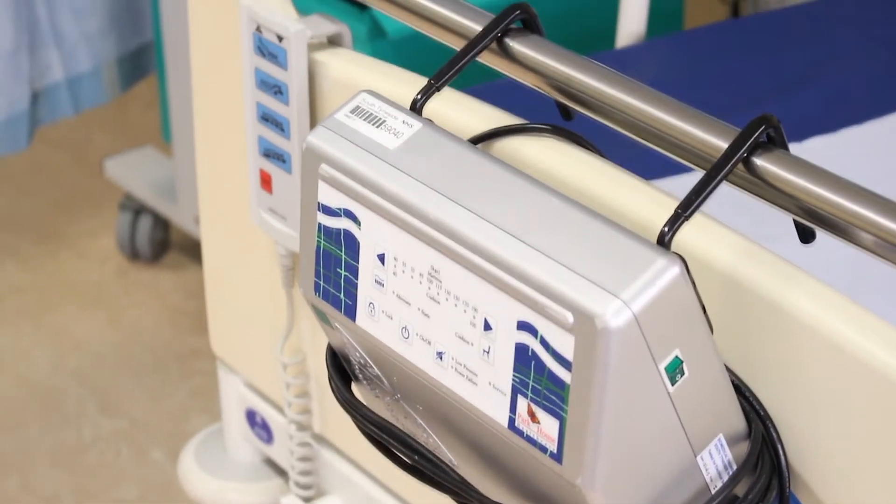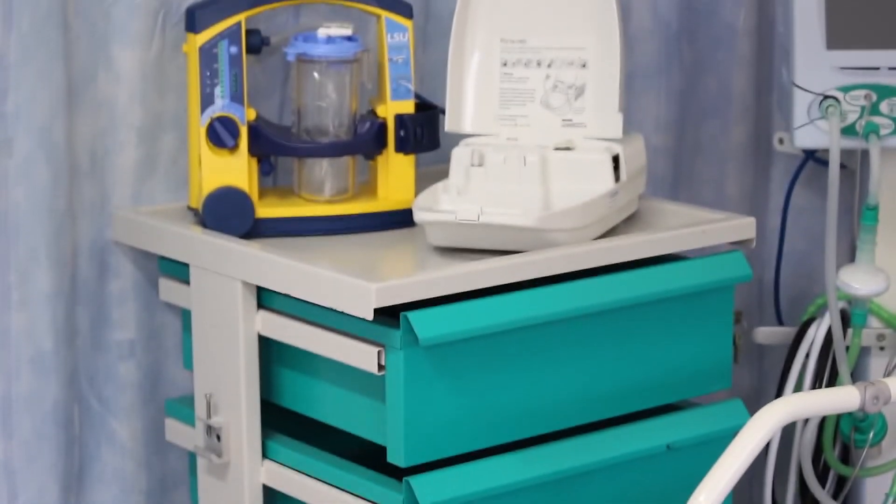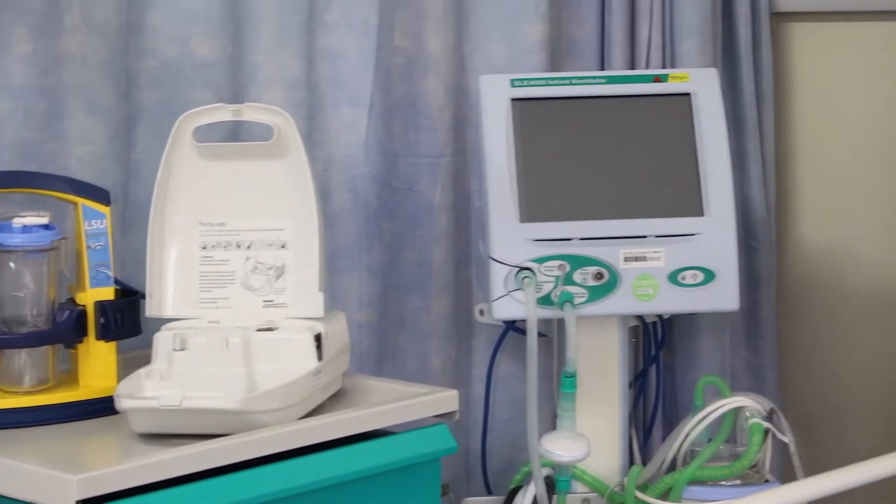Ideal for testing items such as hospital beds, mattress inflators, suction units, nebulizers, ventilators, syringe drivers, infusion pumps, and laboratory incubators.